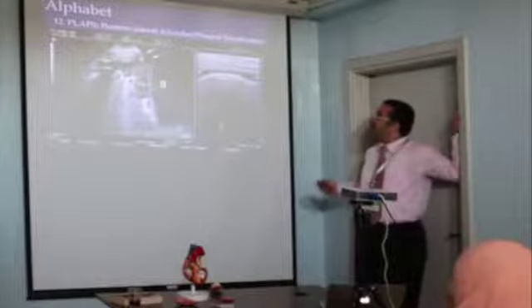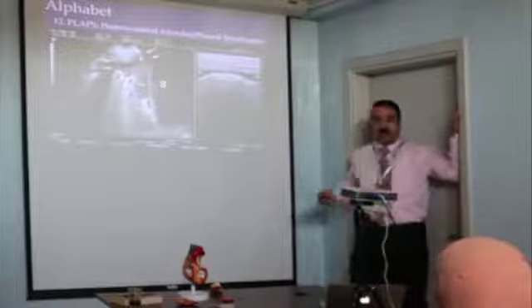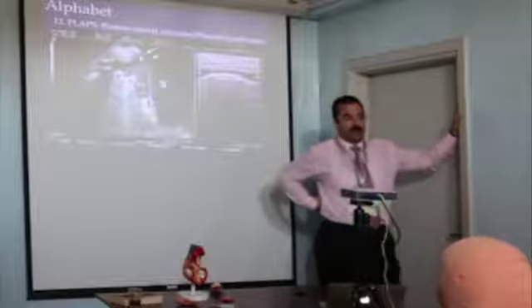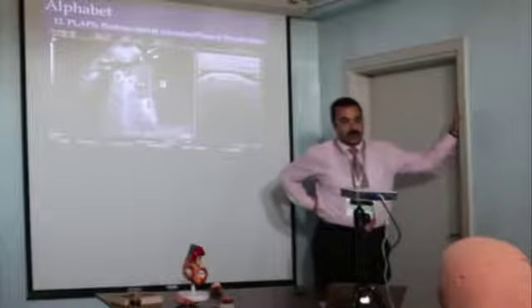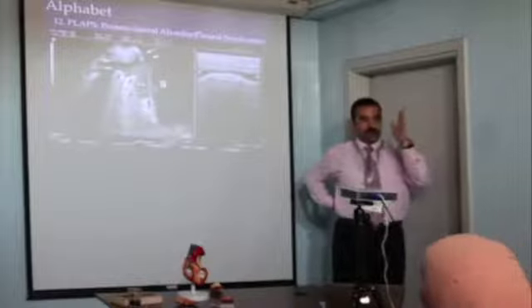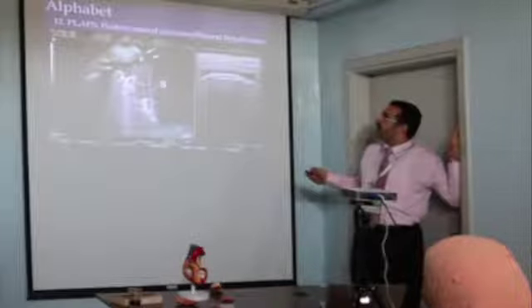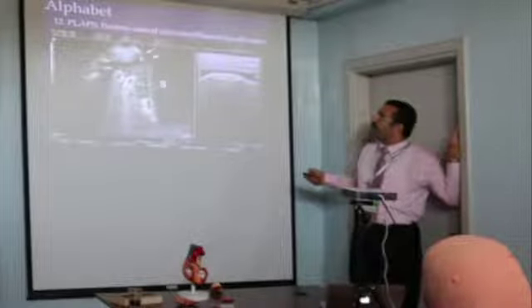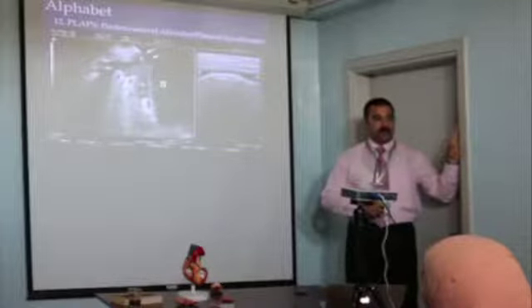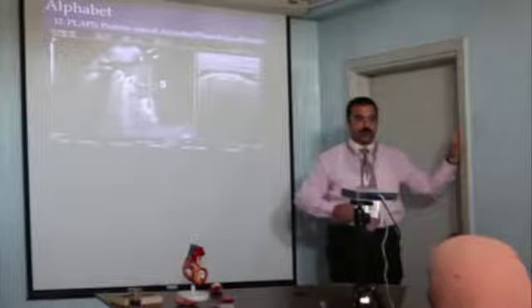Okay, another thick pleura with subpleural consolidation. If this one is in the posterolateral point of the lung, we call that PLAPS. What is PLAPS? Posterior or posterolateral alveolar or pleural syndrome. So, alveolar, because sometimes with thick pleura, shredded pleura, with subpleural consolidation, it's an alveolar consolidation. So, PLAPS. This PLAPS is one of the most important points in my BLUE protocol. Okay?